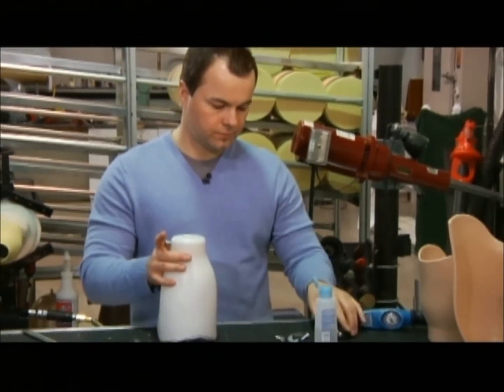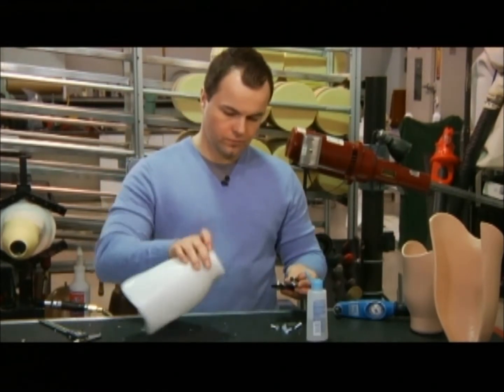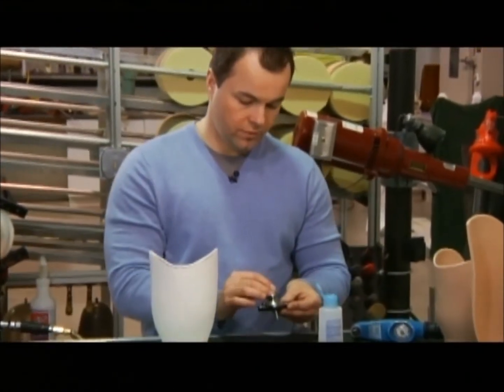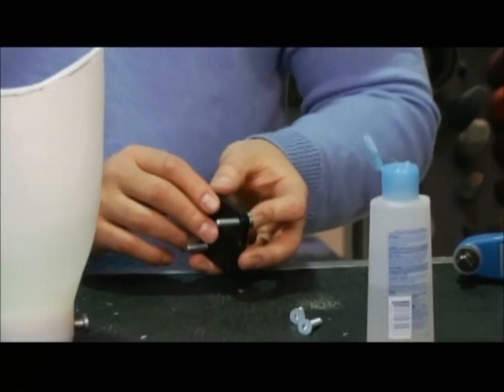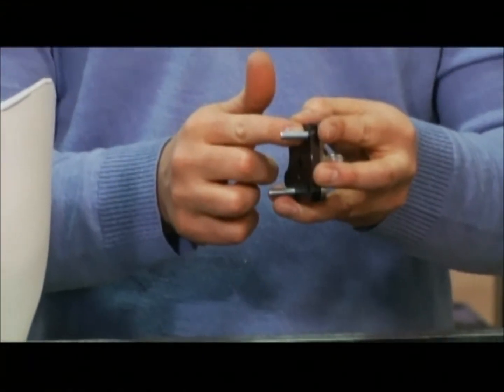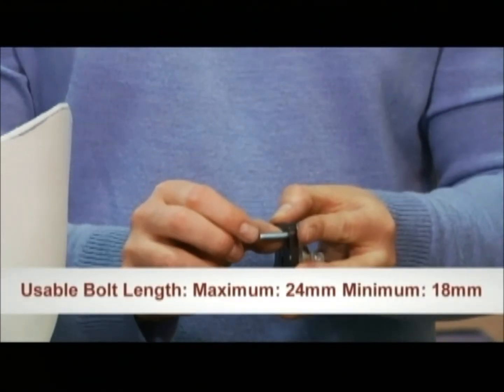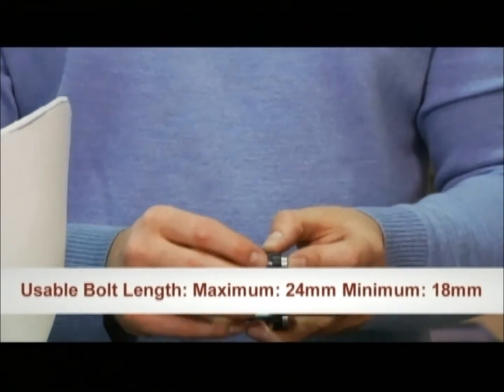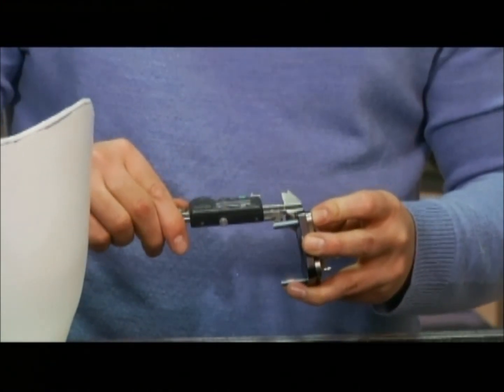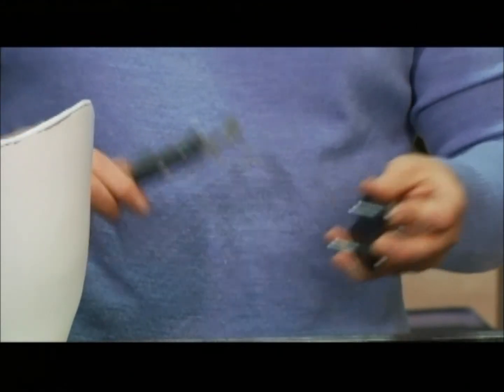The next step is to install the manifold and the distal connector, which brings up a very important point. When you are installing the bolts into your EVLS system — the bolts going into the distal end of the socket — from the bottom of the manifold to the end of the bolt, they cannot be any longer than 24 millimeters, but they have to be at least 18 millimeters. It's a good idea to do a quick check of your bolt length. We have 19 millimeters here, so we're okay.